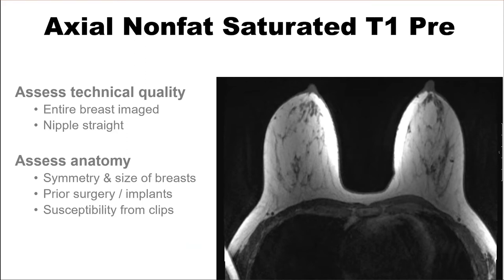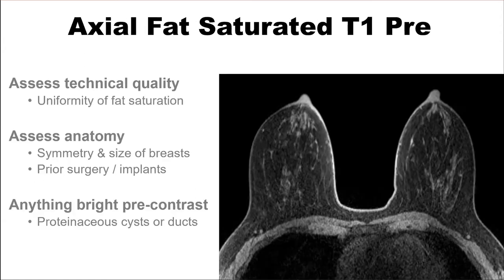The axial non-fat-saturated T1-weighted pre-contrast image — you're looking for technical quality. Is the entire breast imaged, and is the nipple straight? If the nipples are not pointing forward, it can make determining the exact location of an abnormality very difficult as the anatomy gets distorted. Also, on the non-fat-saturated image, look for the size and symmetry of the breasts. Look for any prior surgery, implants, or biopsy clips, as susceptibility artifact is highlighted on this non-fat-saturated sequence.